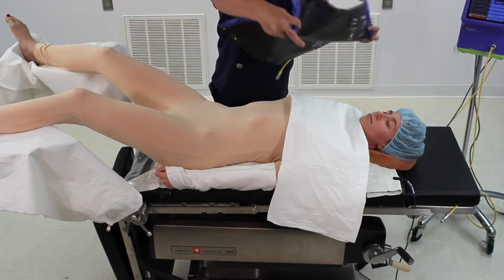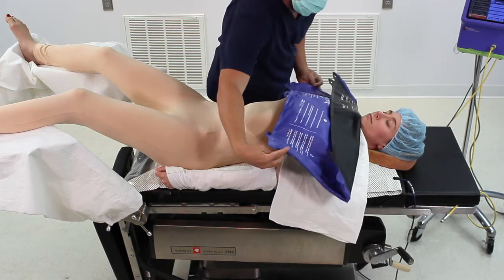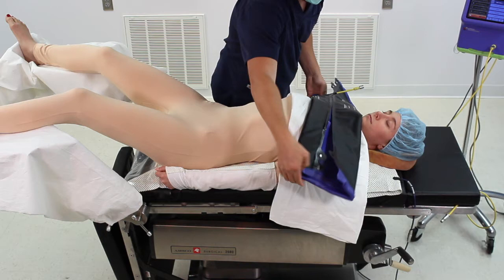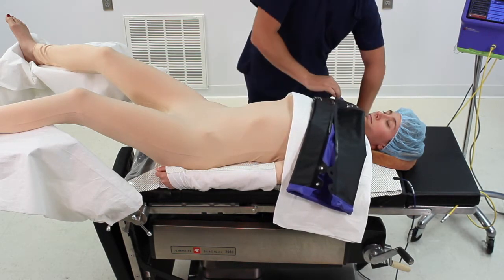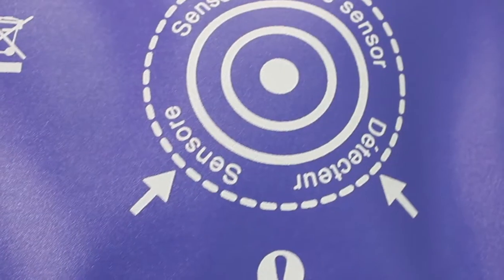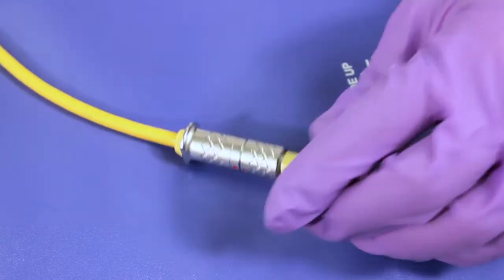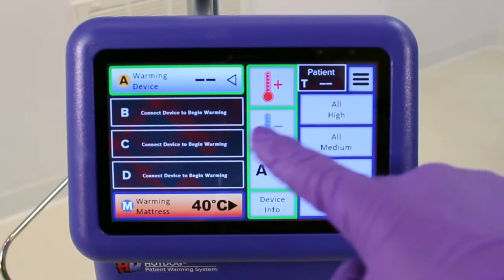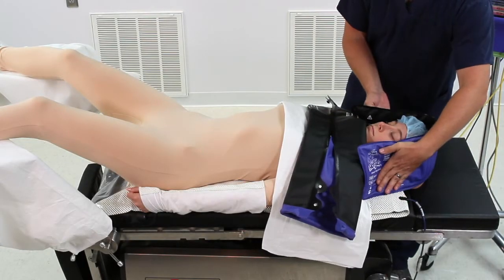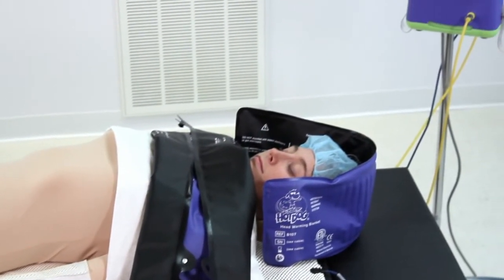To achieve effective patient warming, supplement your efforts with the B500 Universal Warming Blanket. Place it on the patient's upper torso. If necessary, fold it purple side to purple side with the fold against the patient's chin to fit the available surface area. Always make sure that the sensor is still in contact with the patient. Connect the blanket's yellow cable to a yellow cable from the controller and set the temperature to the maximum setting of 43 degrees Celsius. If additional heat transfer is needed, optionally use a B107 head warming wrap to provide the little extra that some patients may need.